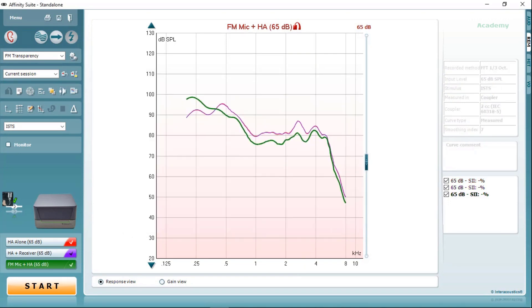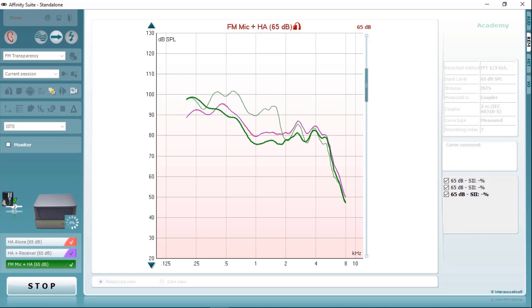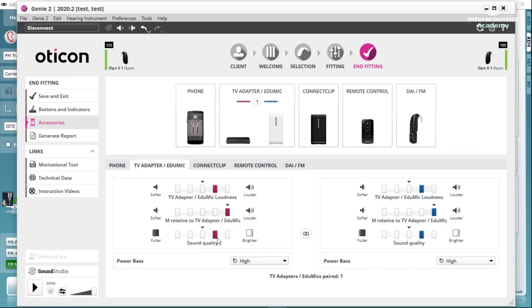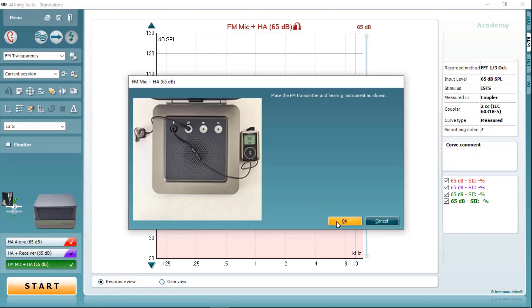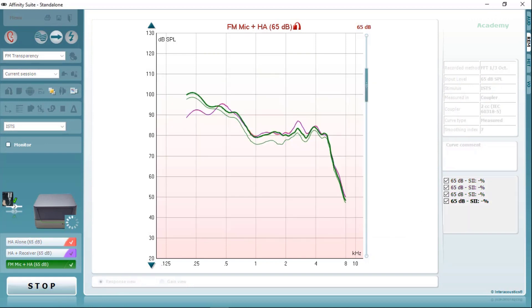Once those adjustments have been made, you can rerun the measurement and another green line will appear on screen. We can see that those adjustments have made some improvement, but there is still a little bit of high frequency response which is not matching the hearing aid response. Therefore, once the measurement has stopped, you can increase the high frequency response in the hearing aid fitting software, and then run the measurement one final time. Here we can now see a much better fitting response to target, and therefore we can say that these two devices are acoustically transparent.